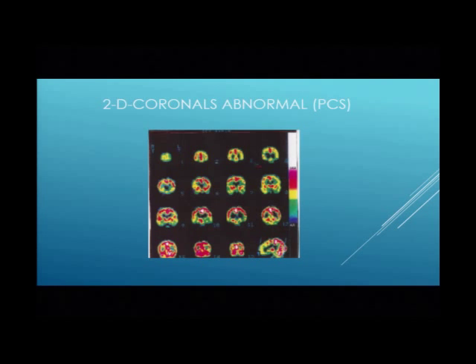And here you can see all the interruptions again. And here's the temporal lobes. This temporal lobe here doesn't even fill out. It's supposed to be a circle. See, this is sort of like a circle. You can imagine a circle here. On the high resolution one, I'll show you the circle, or the wannabe circle. But you can imagine if that was yellow all around, that would be a circle. So this is missing over here, this is missing at the bottom, and all over here. And towards the back of the brain, look at that. It looks pretty good, right?